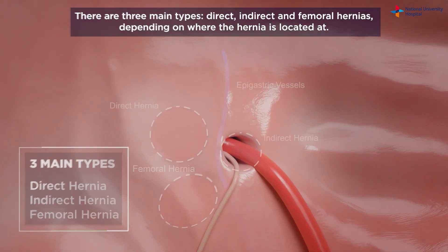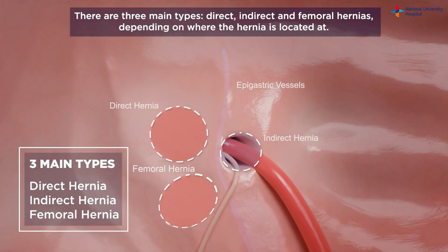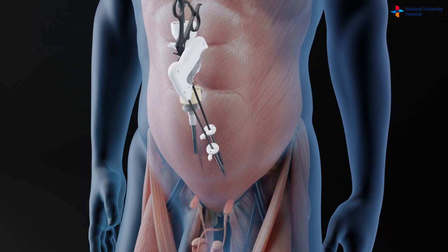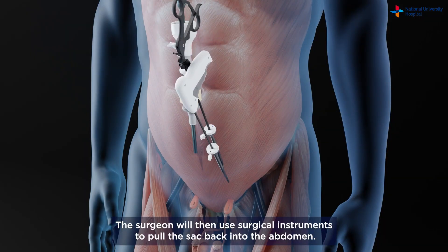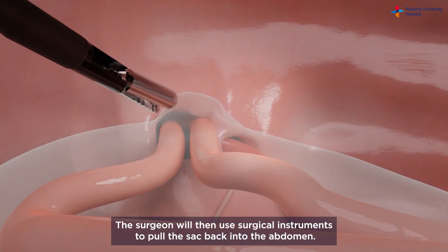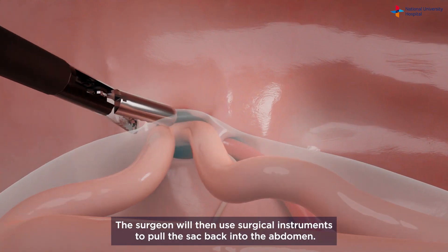There are three main types of hernias: direct, indirect, and femoral. Depending on where the hernia is located, the surgeon will then use surgical instruments to pull the sac back into the abdomen.